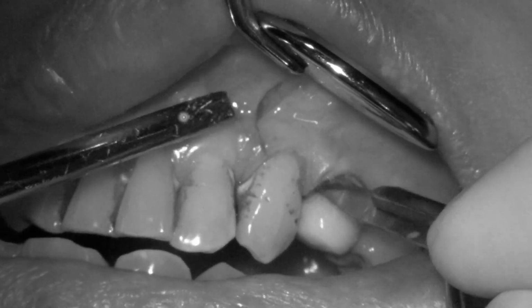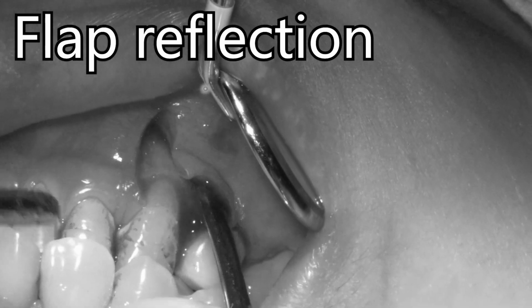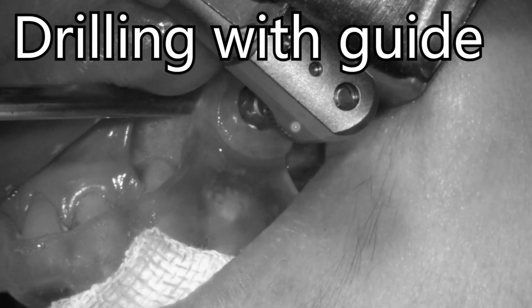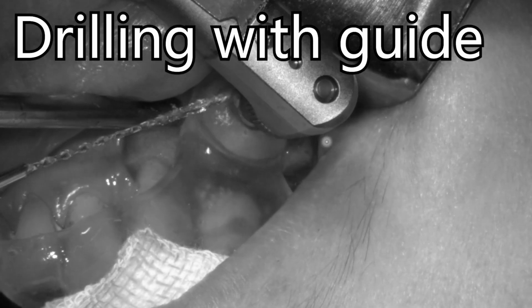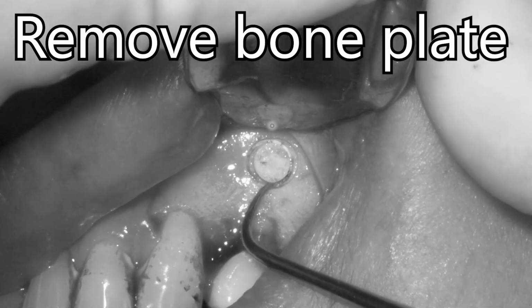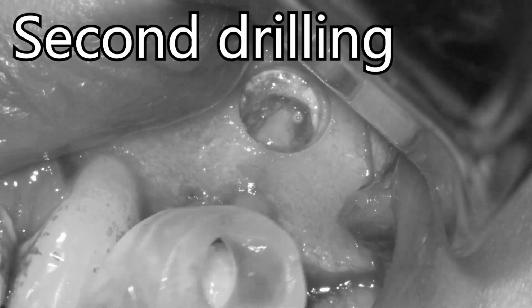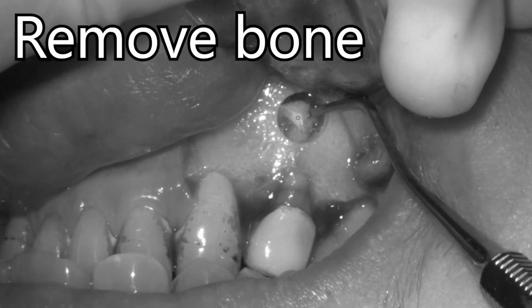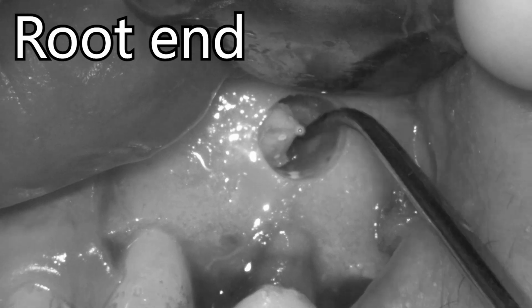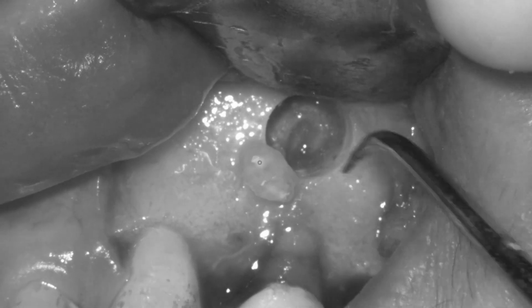First, we do the incision, and we reflect the flap. So our guide is directly attached to the bone surface. If we remove the guide, the bone is directly exposed, and we remove the buccal plate with the trephine bur. After that, we cut this bone segment here, and this one is the root segment, the root end. And as you can see, we have the two canals here.